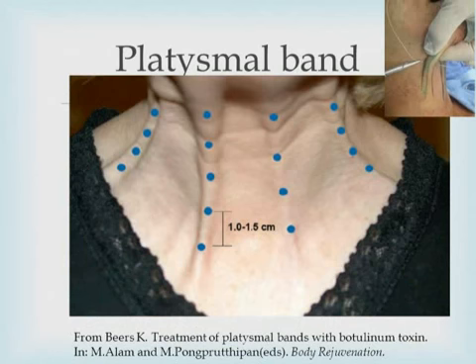You can either, if the patient has a significant long vertical band like this, grab the band up and inject just inside the band.